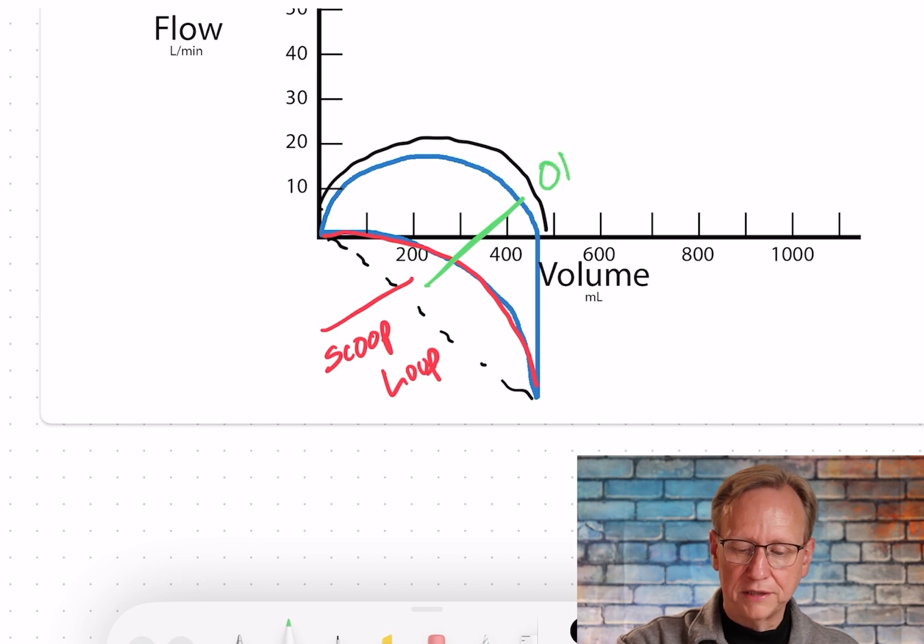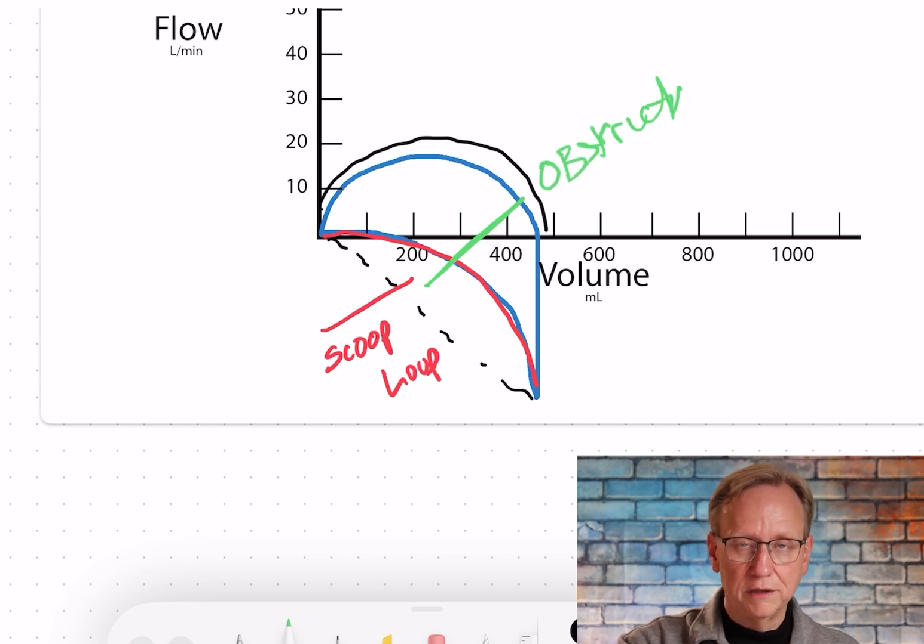As a COPD patient tries to breathe out, their airways collapse, causing an expiratory obstruction — the air can't get out as fast. It starts fast and then slows down because of the way their airways are. This indicates obstruction. If it's COPD, there's not a lot you can do, but if someone has secretions, we can suction them. If they have bronchoconstriction or wheezing with temporary airway collapse, we can give a bronchodilator. For chronic inflammation from asthma, a corticosteroid can help — so for some patients we can get rid of that scoop in their loop.